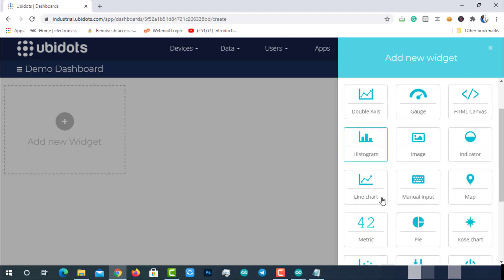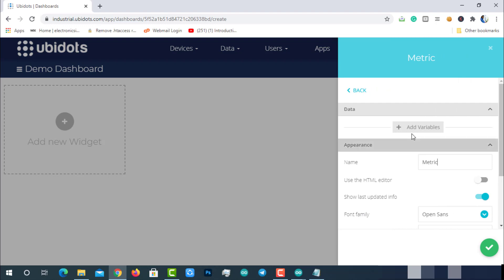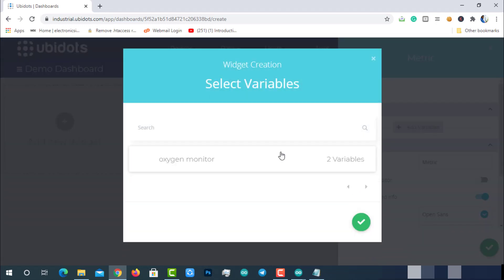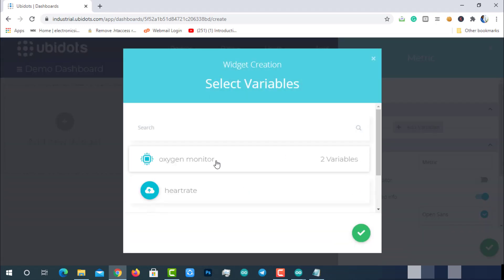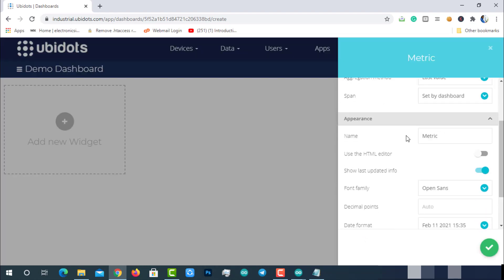I will use a metric to display the heart rate. Click on add variables, then select the device oximeter, and then select the variable heart rate. Add a name for the metric, keep the rest of the options as default, then create it. After creating, you can see the live data on the dashboard.